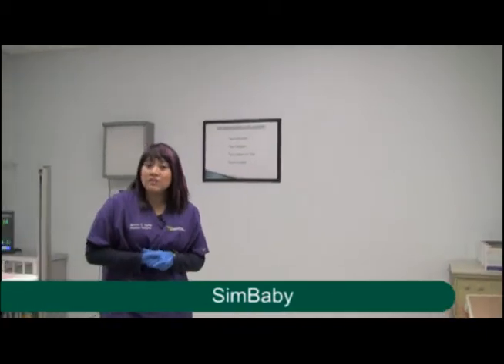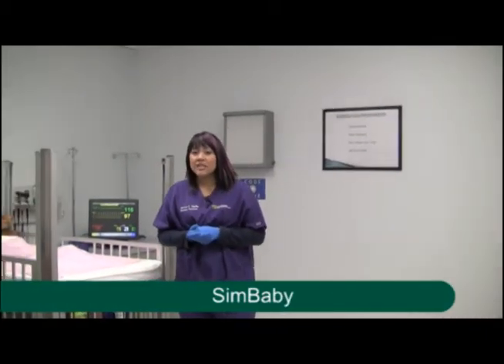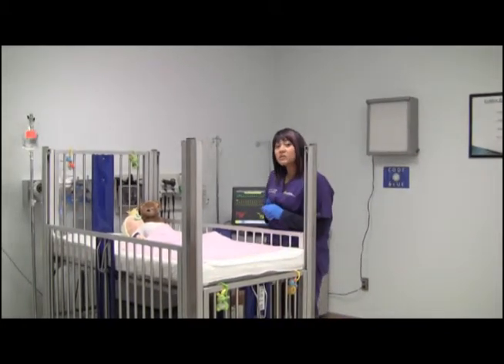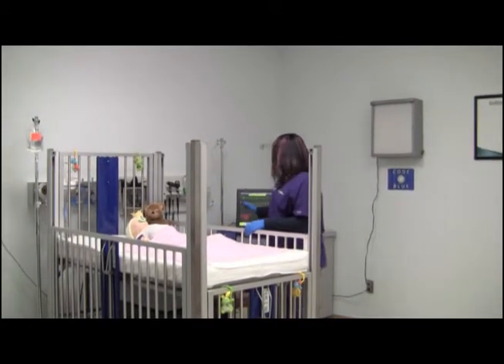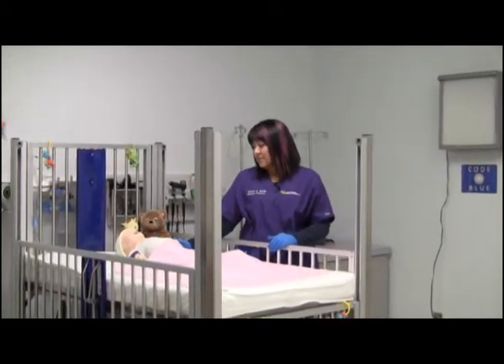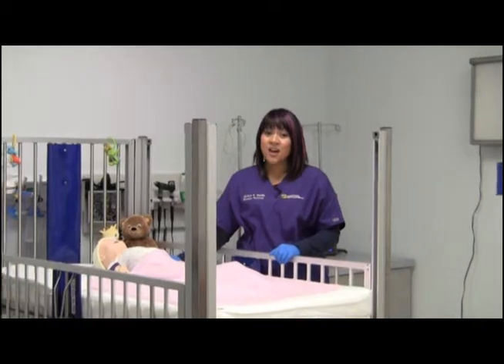In this high-fidelity patient room, Laerdal's SimBaby is the usual patient. To name a few of SimBaby's features, you may auscultate heart, lung, and blood pressure, practice airway occlusion and intubation, monitor ECG, cyanosis, and seizing. The list goes on.